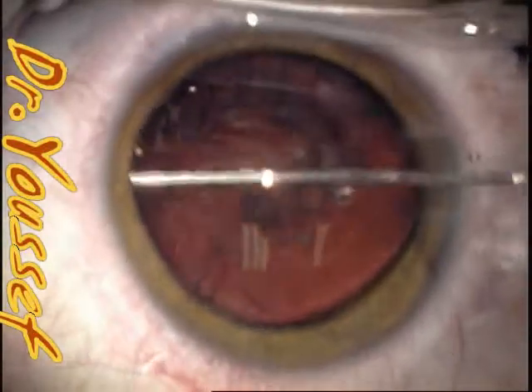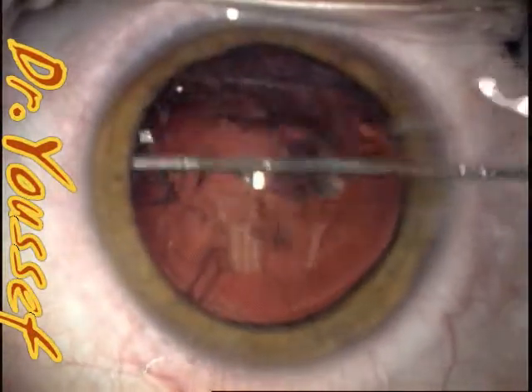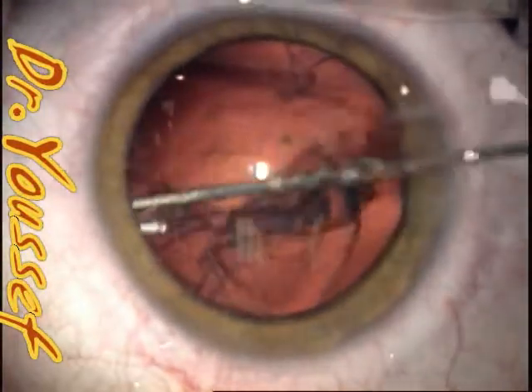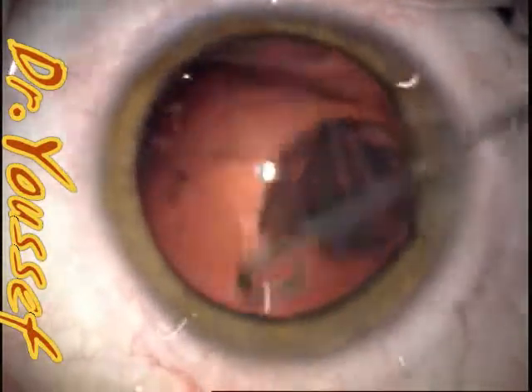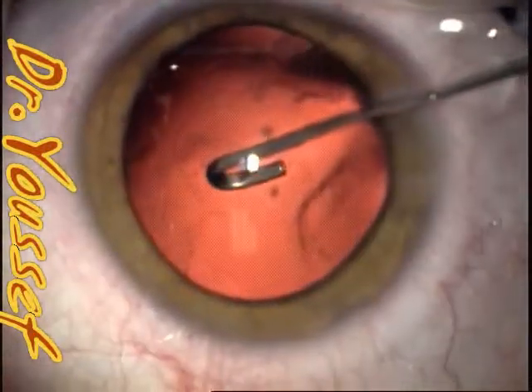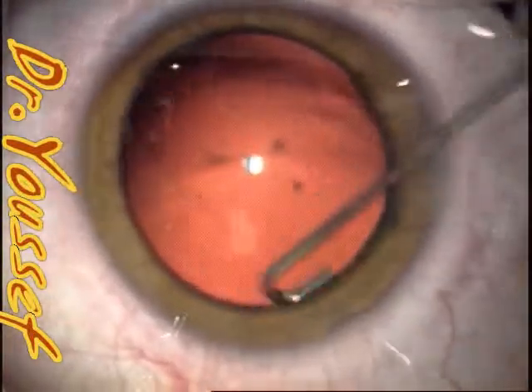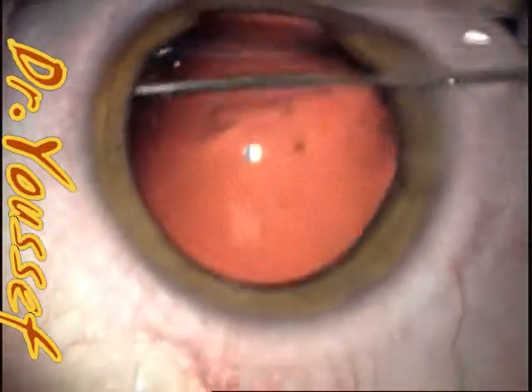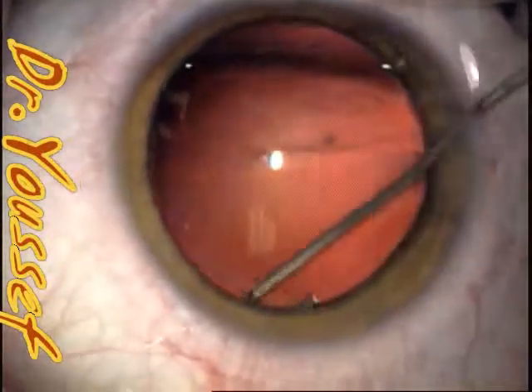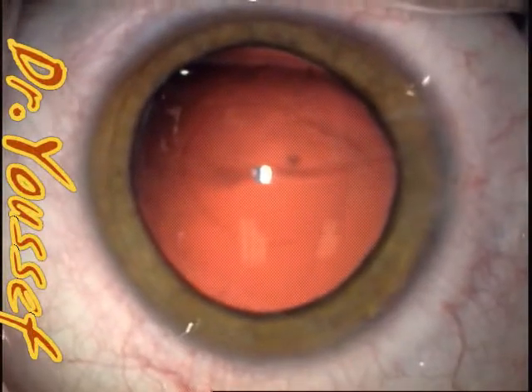We don't need to do posterior capsulorhexis, as the kid is old enough to sit at the slit lamp later if the capsule becomes opacified. The J cannula is used here as with adults — we wash the material, clean the capsule, and clean cortical material from the fornix as much as we can. This decreases scarring, because the younger the patient, the more active the cells and the more chance of posterior capsule opacification. The J cannula cleanses all the cells, even in the fornix where you can't see.